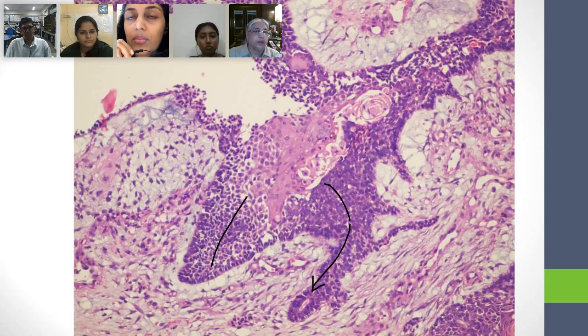Say I have a lipoma. All the cells in that tumor, are they looking like normal lipocytes? Are they dysplastic? I have an adenoma in the colon. Yes, it's a benign tumor, right? Now, are those cells dysplastic? So these cells need not be dysplastic. They look like basal cells, so they are basaloid.